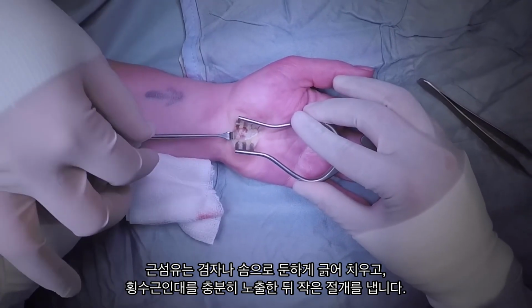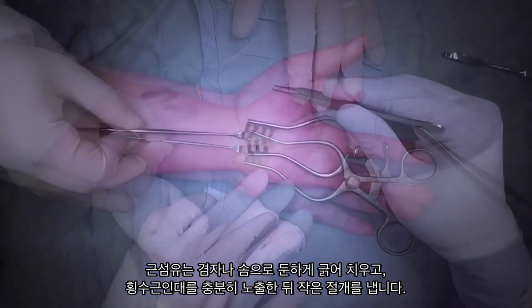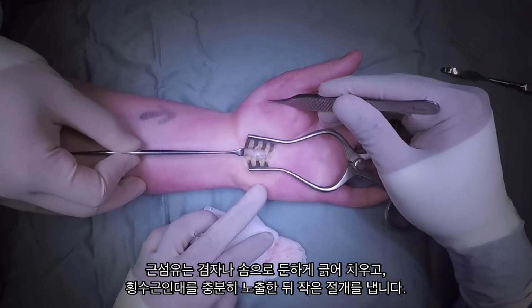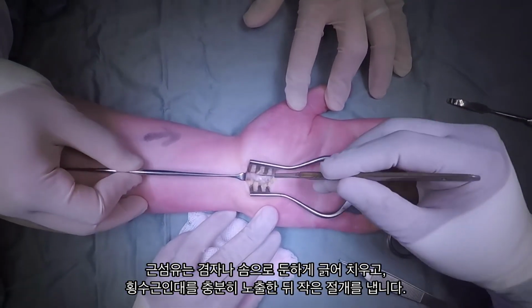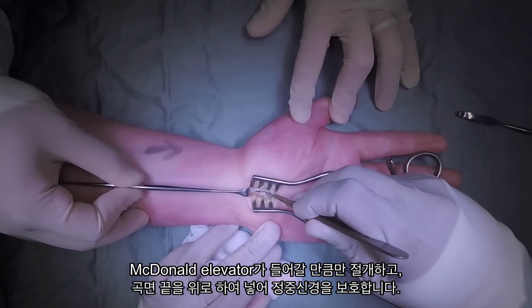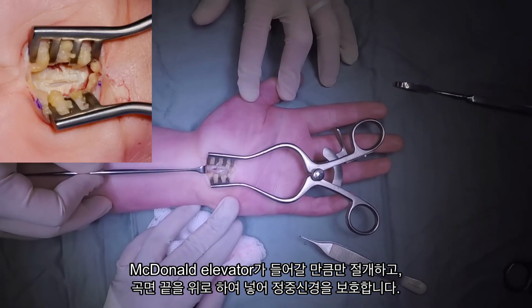Our assistant here has put the flat end of a Sen retractor into the wound to give us a slightly better view. The transverse carpal ligament is seen here fully exposed, with the transverse fibers visible as we saw before. Now we're ready to incise the transverse carpal ligament, again in line with our skin incision. We're going to start by making a small incision in the ligament using the blade. Do this gently and carefully to avoid damaging the structures underneath. It has to be long enough to be able to admit a McDonald's elevator.